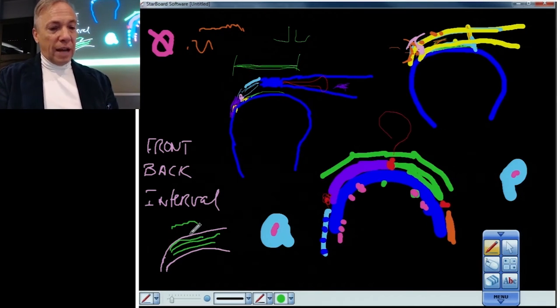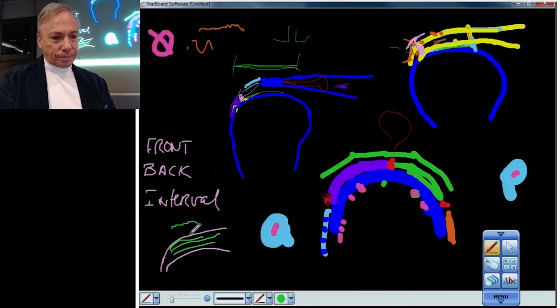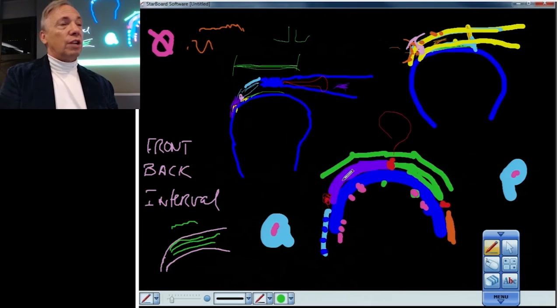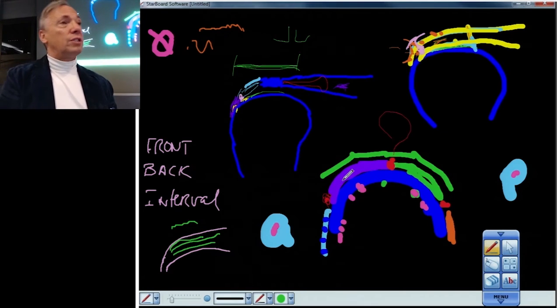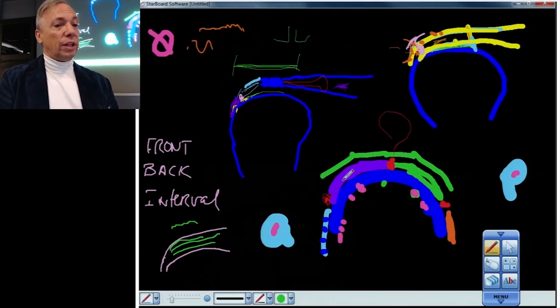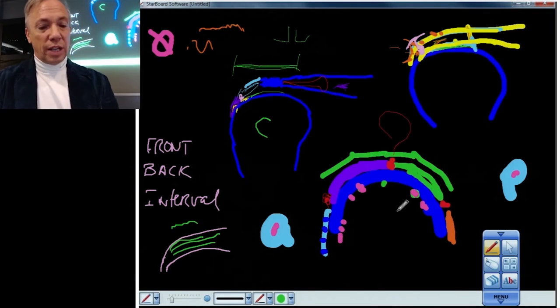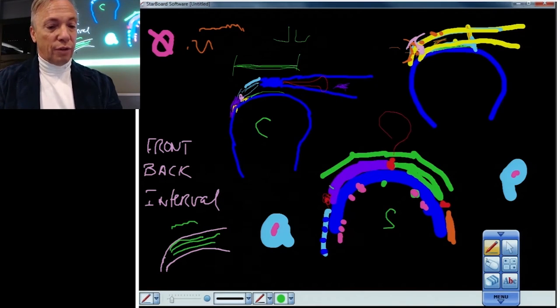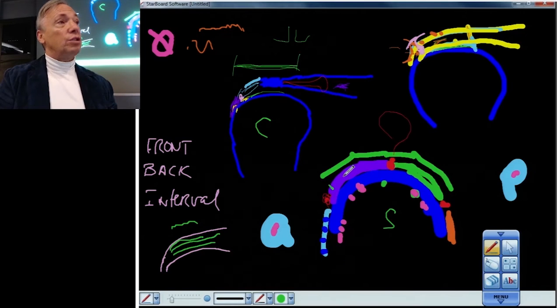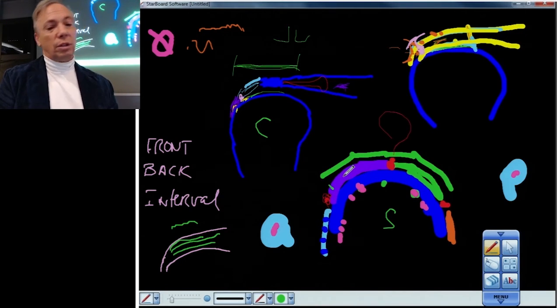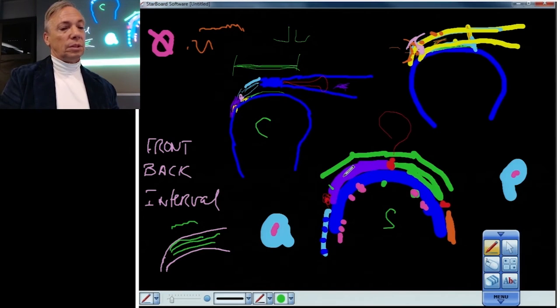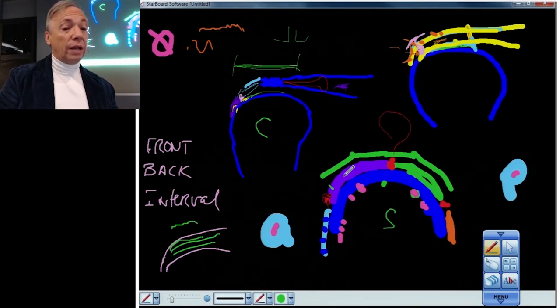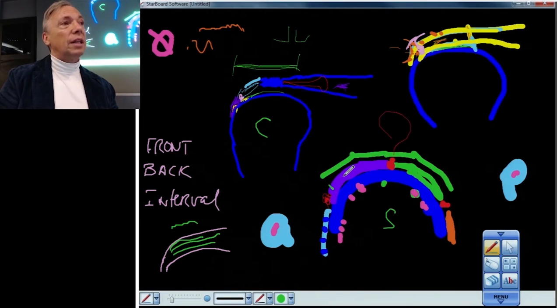Now let's go back to the sagittal projection for a moment. One of your colleagues was asking about the very far anterior fibers that go to the lesser tuberosity and go over the greater tuberosity. And those can be really challenging in the coronal projection. So those tears are often over here. And you can't see them unless you have a great thin section, one or two millimeter axial and a sagittal PD spur. They're going to be all the way in the front. And they are usually quite unpleasant and symptomatic even if they are small.